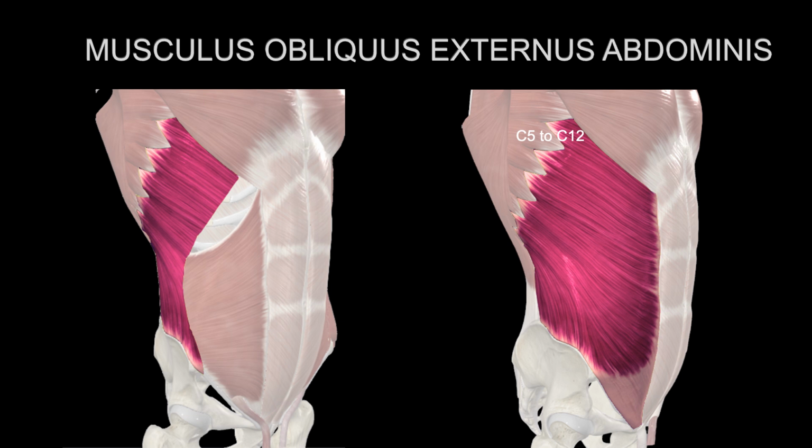Even more superficial is the external oblique muscle, which originates from the ribs between T5 and T12. It lies close to the serratus anterior with shared fibrous attachments. It also attaches broadly to the thoracolumbar fascia and the iliac crest, and its aponeurosis contributes to the lower front part of the abdominal wall, along with the internal oblique and the deeper transversus muscles.